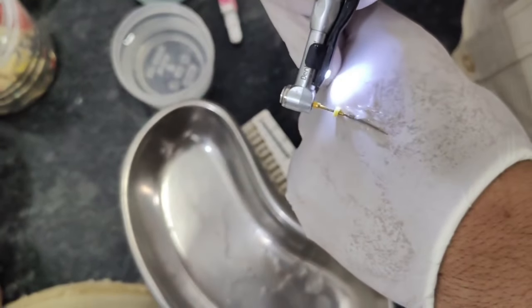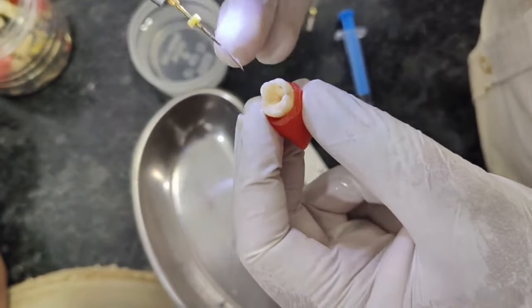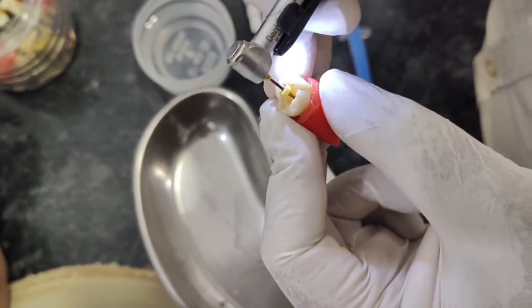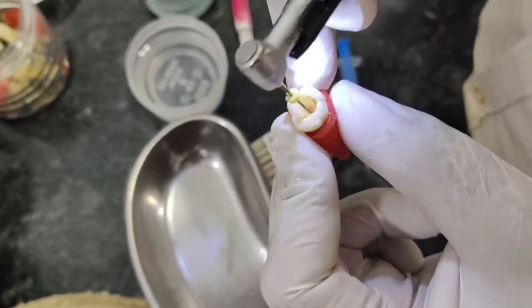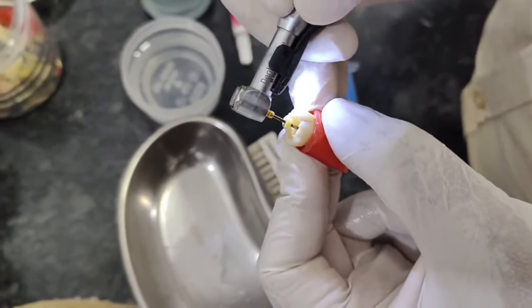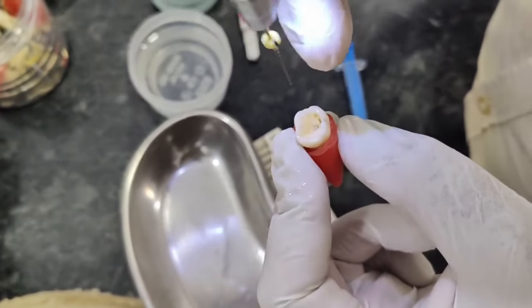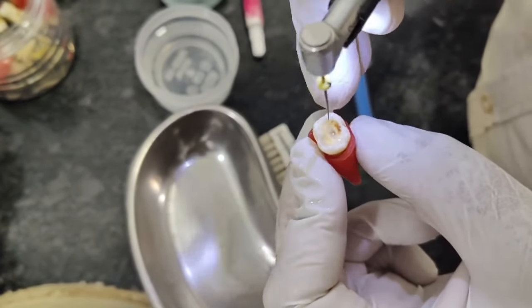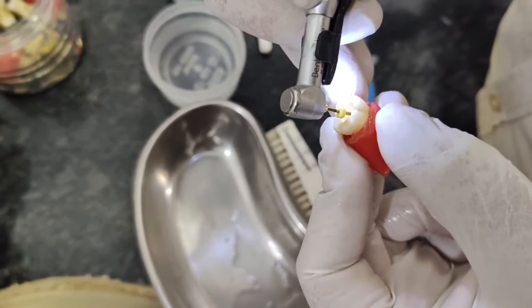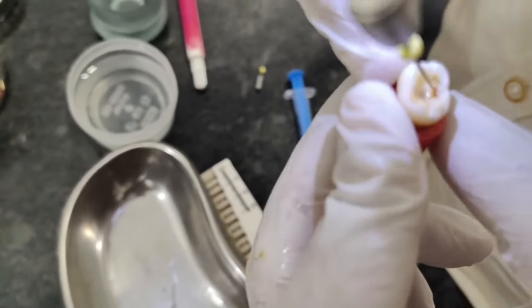Now again we are lubricating the file. Now we are putting it in the distal canal. So this is the 4% 20 file. Again we are putting the 4% 20 file inside. This is the distal canal. See the angulation again. You should not cross the working length, otherwise there will be transportation of the canal. Means your file will go beyond the apex and the apex will become larger in size. The patient may have chances of infection. This is the mesiolingual canal. This is the mesiobuccal canal.